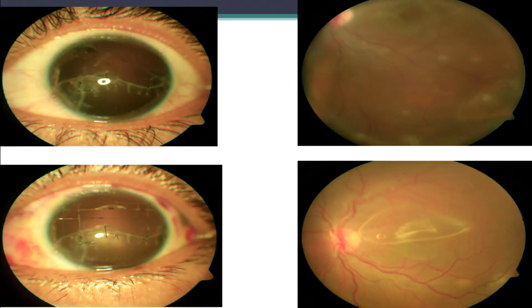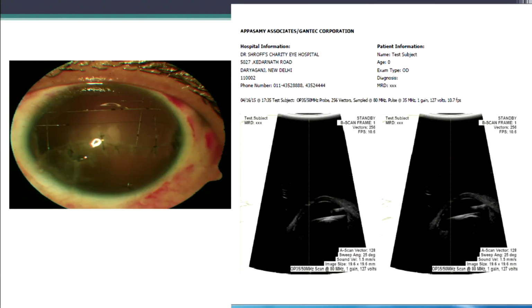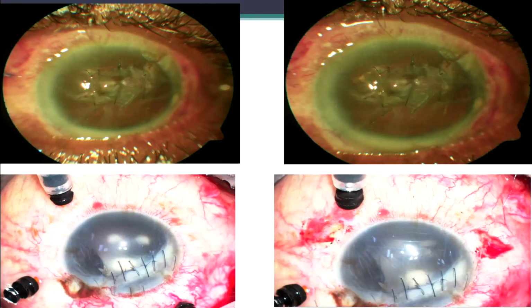These are some of the cases. You can see aniridia with aphakia, with corneal tear repair, with detachment. These are post-operative patients. You can see the Prolene mesh and silicone oil. If you see the UBM study, you can see the silicone oil meniscus behind the sutures. So these sutures were preventing silicone oil migration into the anterior chamber. There is another patient of trauma, a one-eyed patient. You can see silicone oil barrier sutures, and in this patient, silicone oil migrated into the AC because of the anterior PVR, and this is another patient. You can see sutures here.